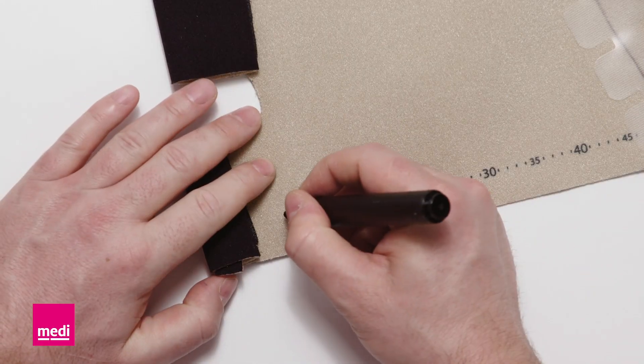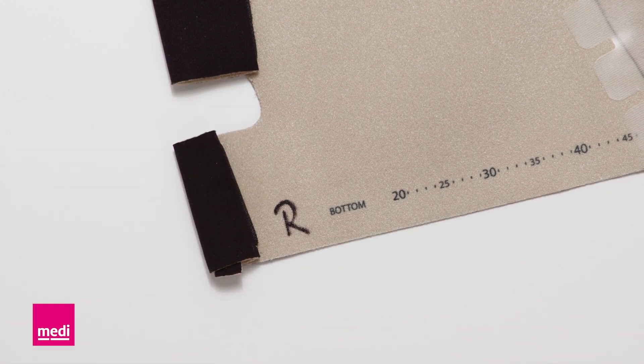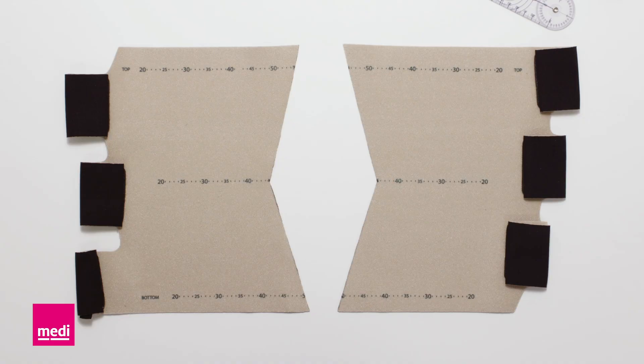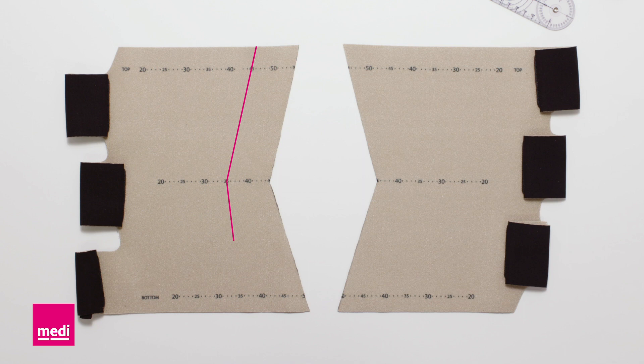Label the garment for the right or left leg accordingly. As soon as the leg has decreased significantly in circumference, trim the garment to the new measurements and remove the excess material.